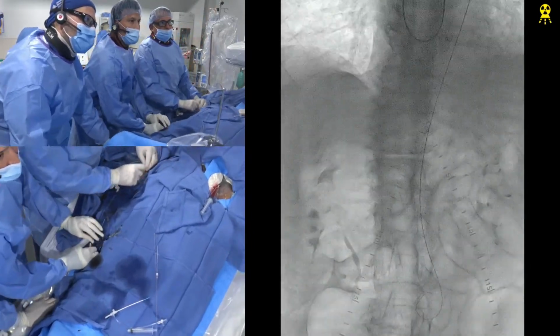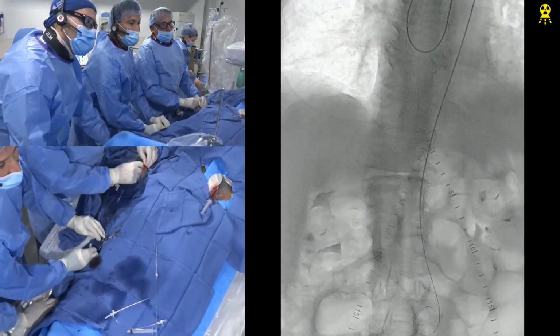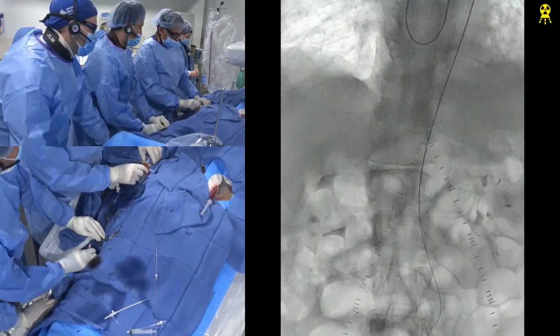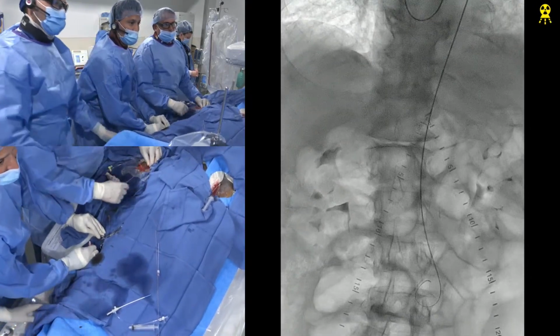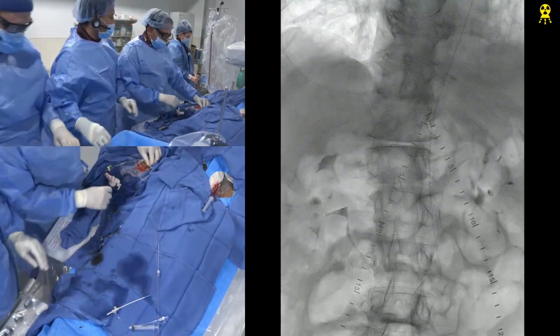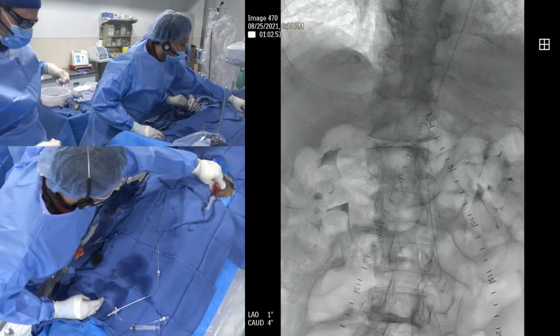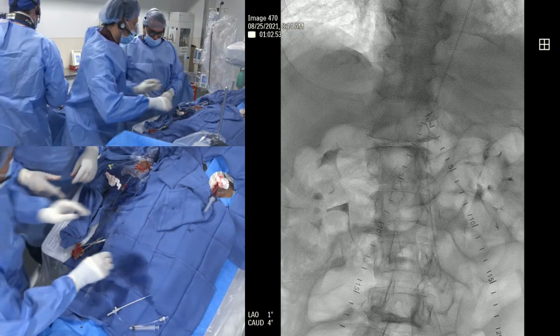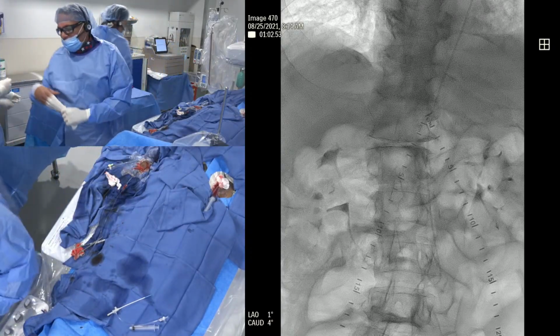Okay, I'm going to show you up. You got it. Relax. Yeah, that's what he's doing. Relax, don't move your hand. I think he's feeling the stress. Good. All right, so the pigtail is back down. Give antibiotics, Liz. Okay, let's flush this one out. Let me get another glove. All right, so now let's get back to the case.